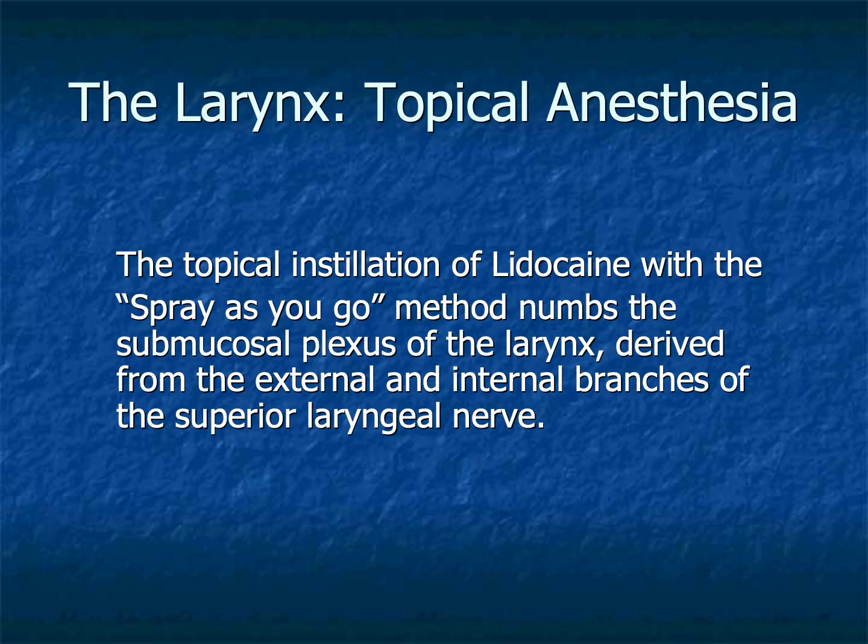The spray-as-you-go technique represents more than simple anesthetic delivery. It reflects an important philosophy of procedural bronchoscopy: gradual progression, careful preparation, and respect for patient physiology. Experienced bronchoscopists learn that smooth procedures are usually quiet procedures. Calmness, patience, and anticipation matter.